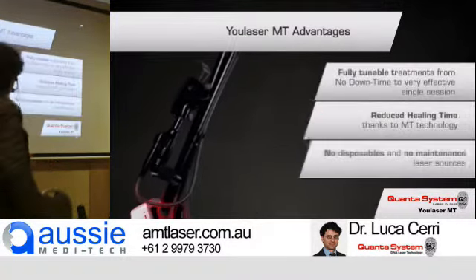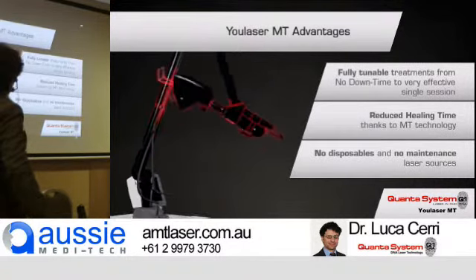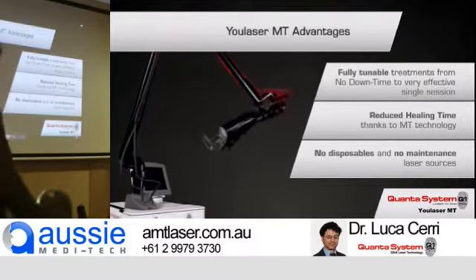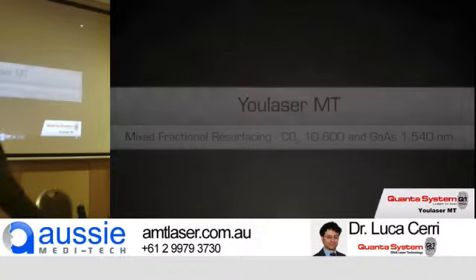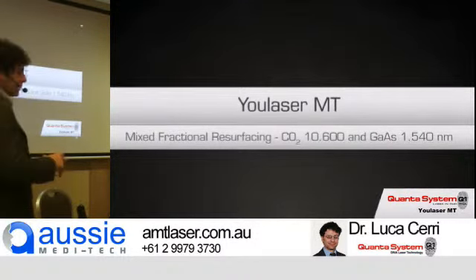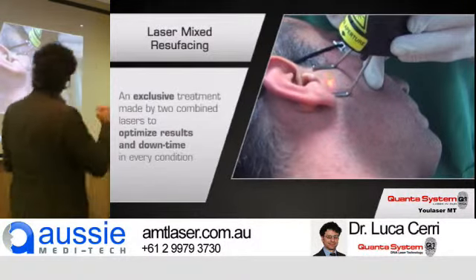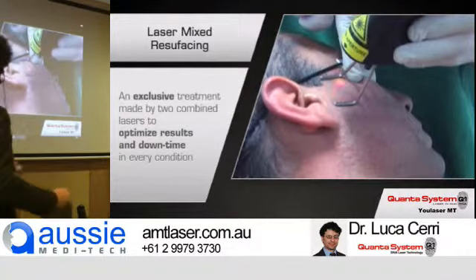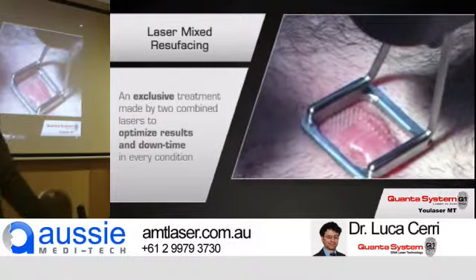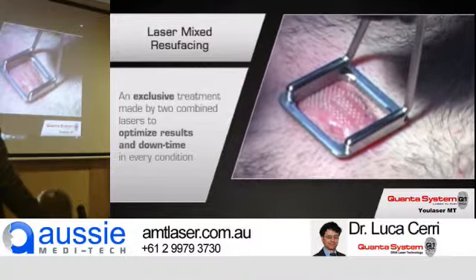So, two lasers in one device with this really revolutionary approach for rejuvenation, and not only, because it's really giving great satisfaction in the treatment of scars and acne scars. So, post-surgical scars, acne scars, keloids, due also to the effect of these two wavelengths, for example managing the instability of a keloid through the vascularization made by the 1540 and the ablation at the same time.